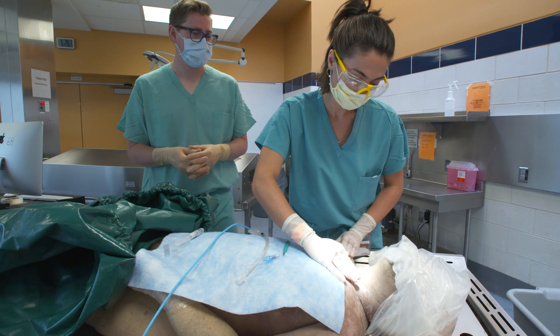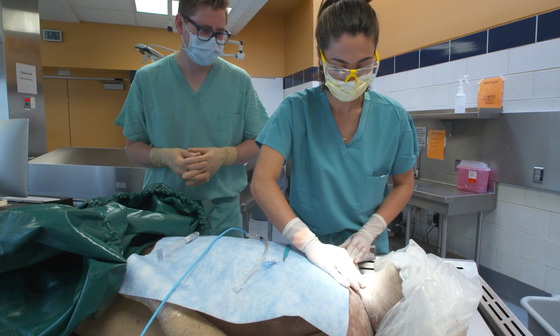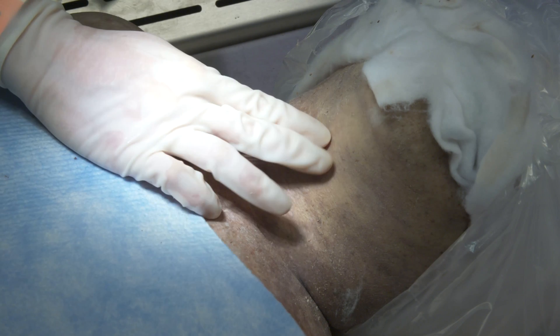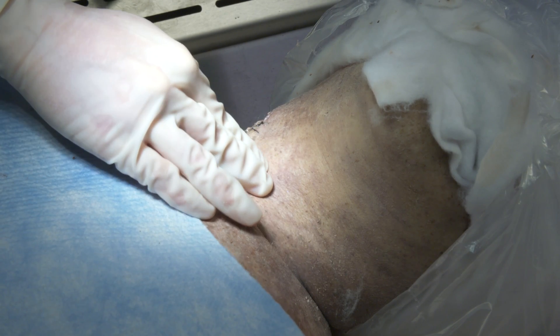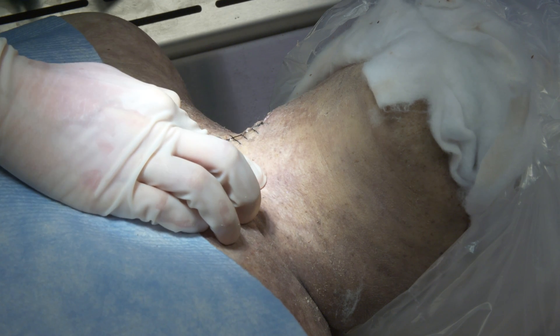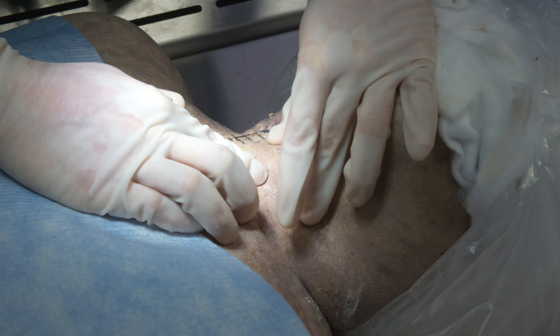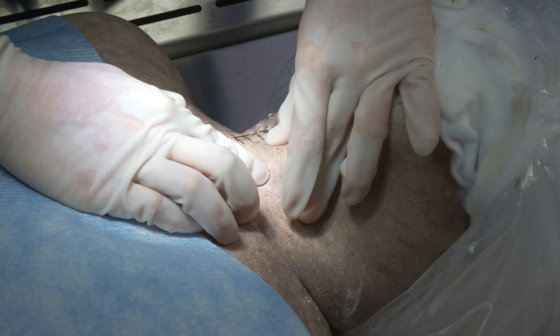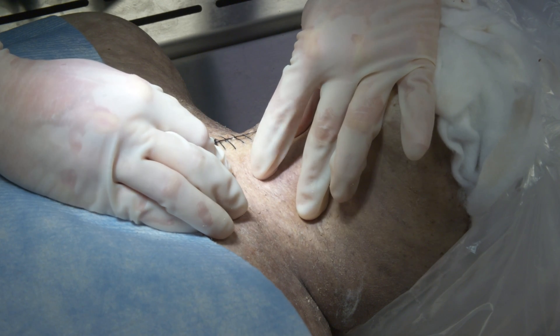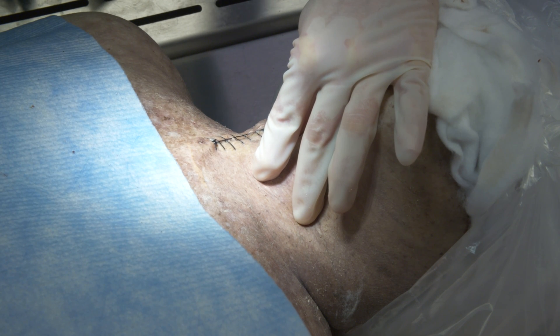Using our first cadaver, medical student Katerina is going to demonstrate how to quickly locate the cricothyroid membrane. First, palpate the thyroid notch. Then move your finger inferiorly to palpate the cricoid cartilage. The cricothyroid membrane is the small, soft region between these structures. It is best felt with the tip of your finger. After locating this region, you are ready to perform the procedure.